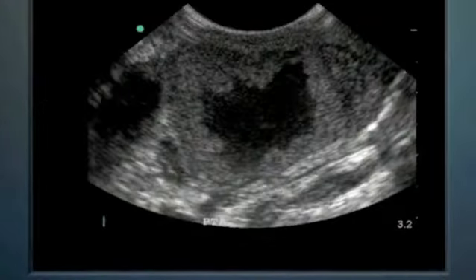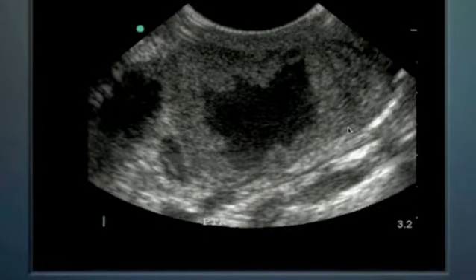This is a very large peritonsillar abscess. We see over here that these are 0.5 centimeter hash marks, so 0.5, 1, 1.5, 2, 2.5, 3, a little bit more gives us to 3.2 for the depth. And so this is measuring anywhere from this mark all the way down to, this is about a 1.5, almost a 2 centimeter in its longest axis diameter peritonsillar abscess. You think about that, it's a very large one here, very prominent, and this is the intracavitary transducer we have in the mouth, and we can see that very prominent peritonsillar abscess here.